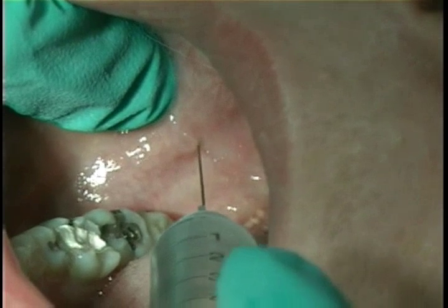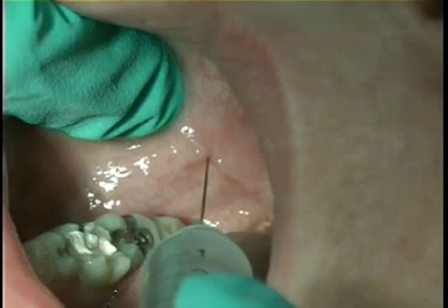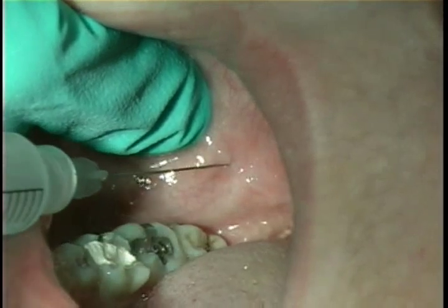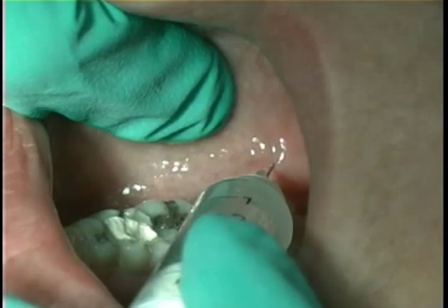Local anesthesia is given using 2% lidocaine with epinephrine with a disposable syringe. The technique is the indirect or walking technique, where the external oblique ridge serves as the anatomical landmark for locating the IA nerve.